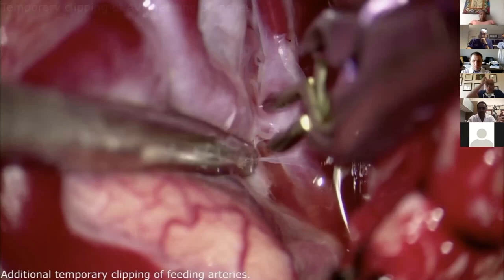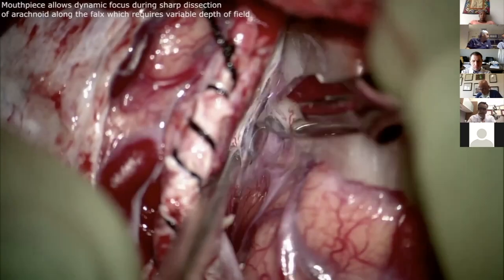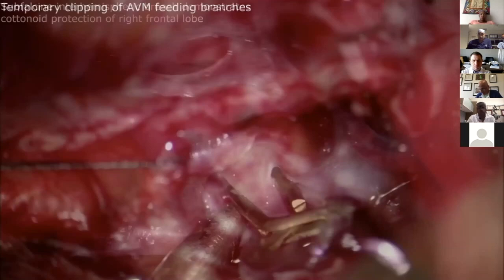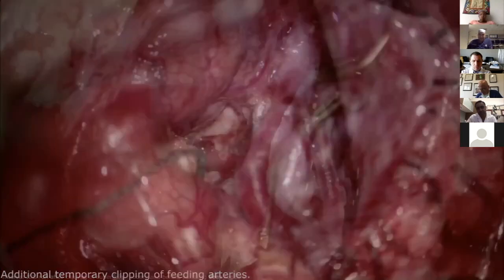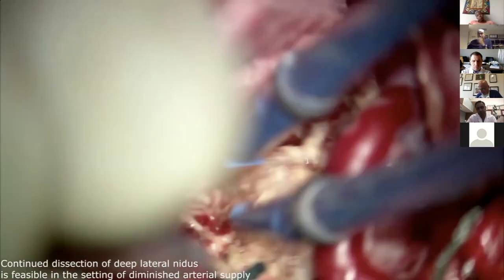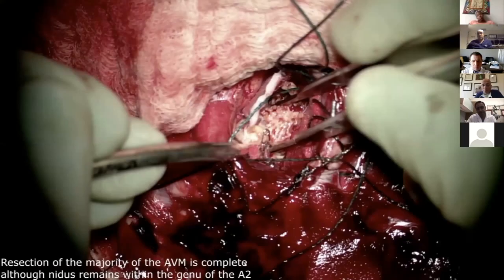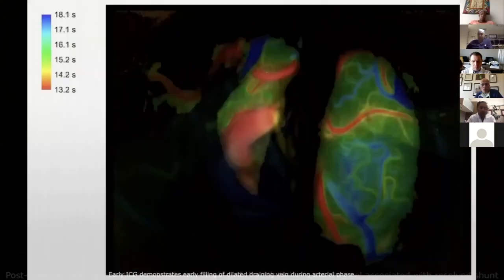And as I was saying, I wanted to show you that was the interhemispheric approach coming from the opposite side, cutting the falx, and now we can go back and forth. Again, the principles: take the arterial feeders, here are the clips. It makes the AVM so much softer before going into the brain. And then by going along the white matter and sweeping the venous loops back in, here's the deep feeder. And then at the end of the operation, even part of the calcified AVM should come out. And then the rest of the en passage vessels are filling well.